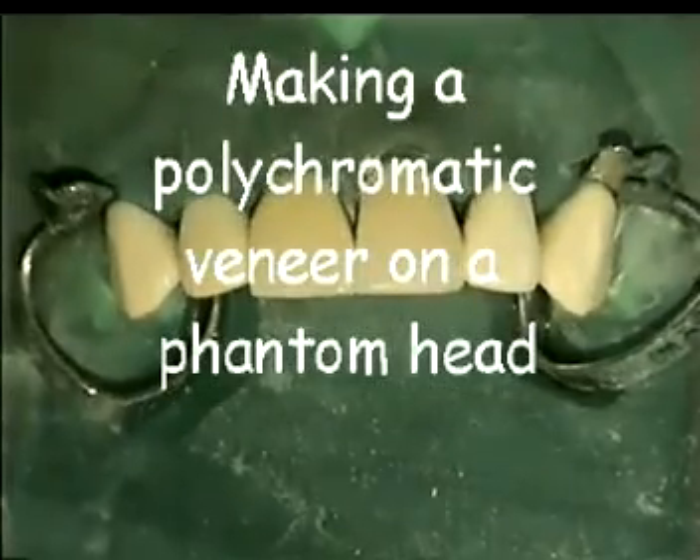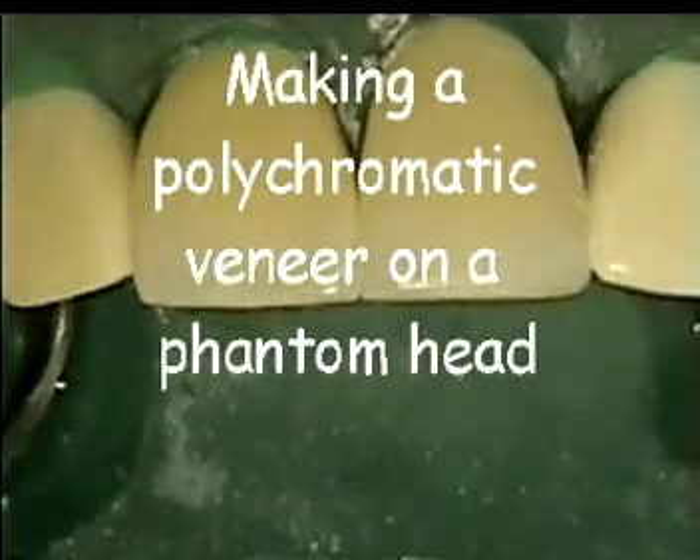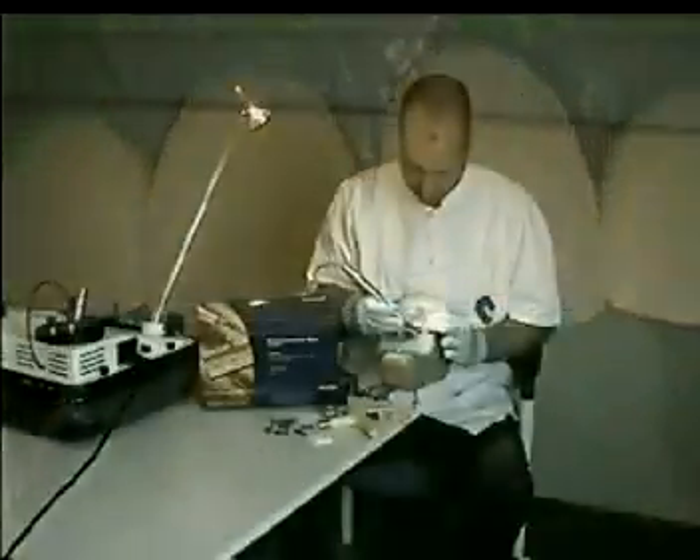On this video we will demonstrate how to make a polychromatic veneer. For the demonstration we used a phantom head.